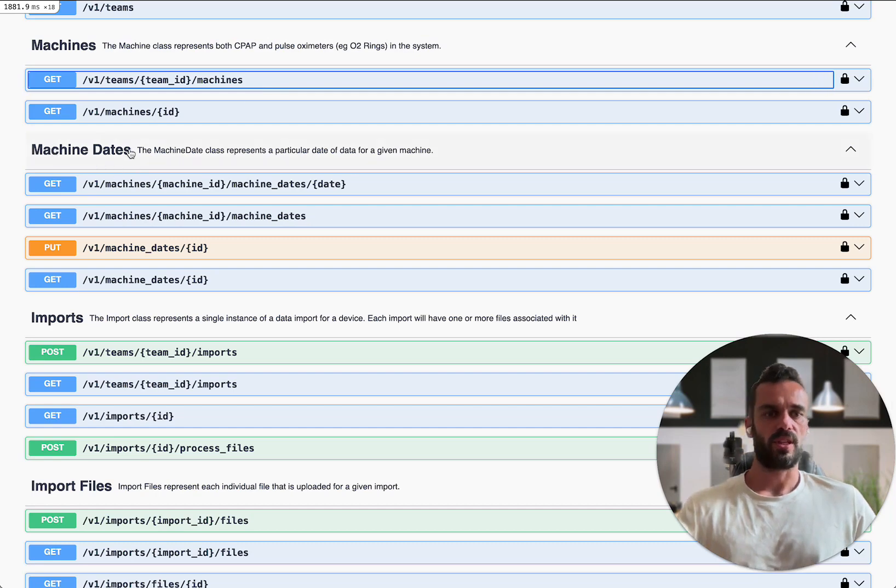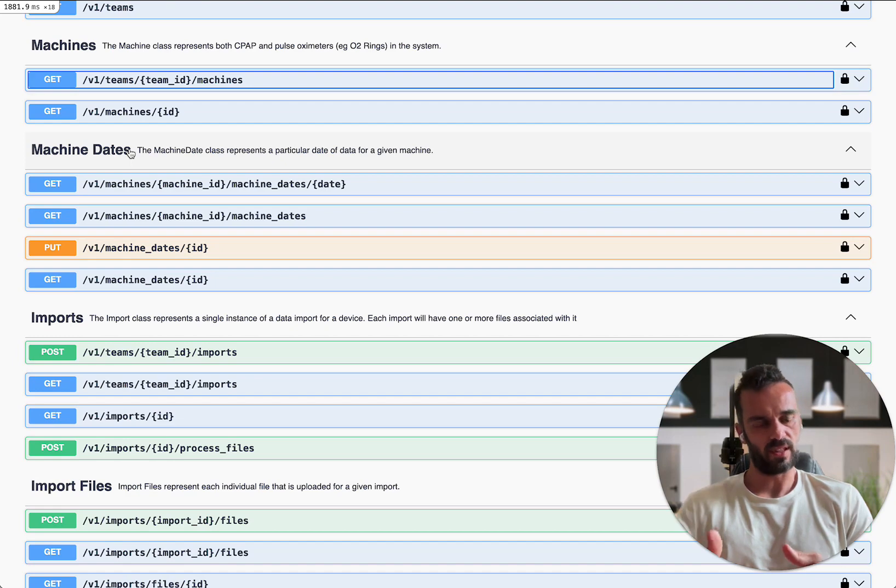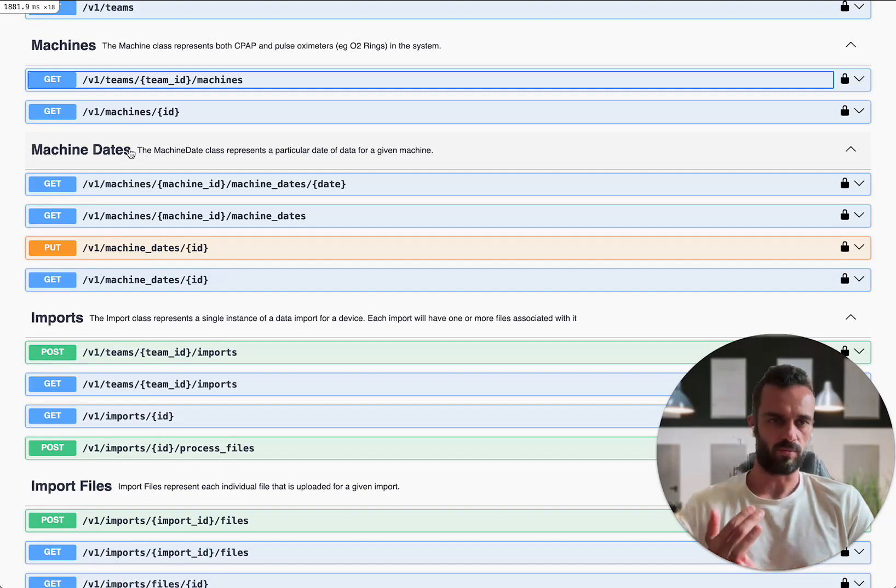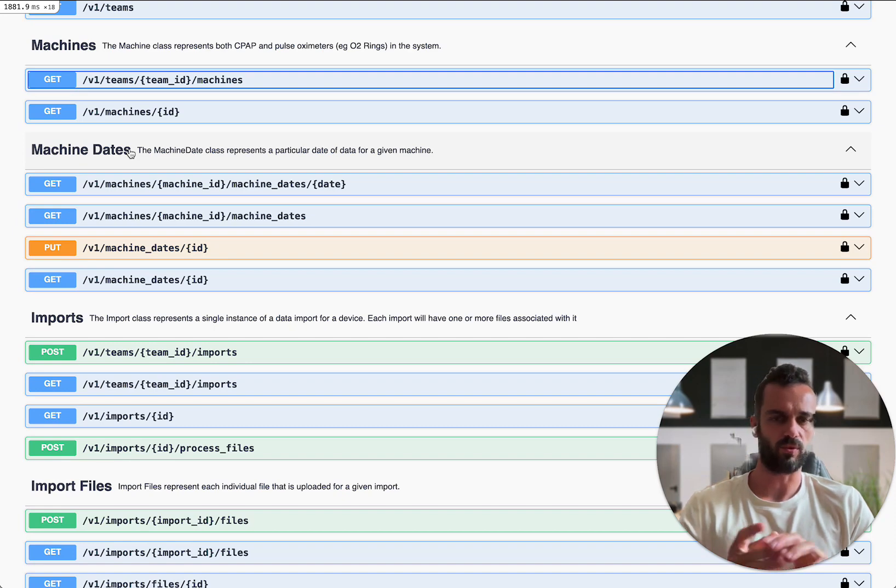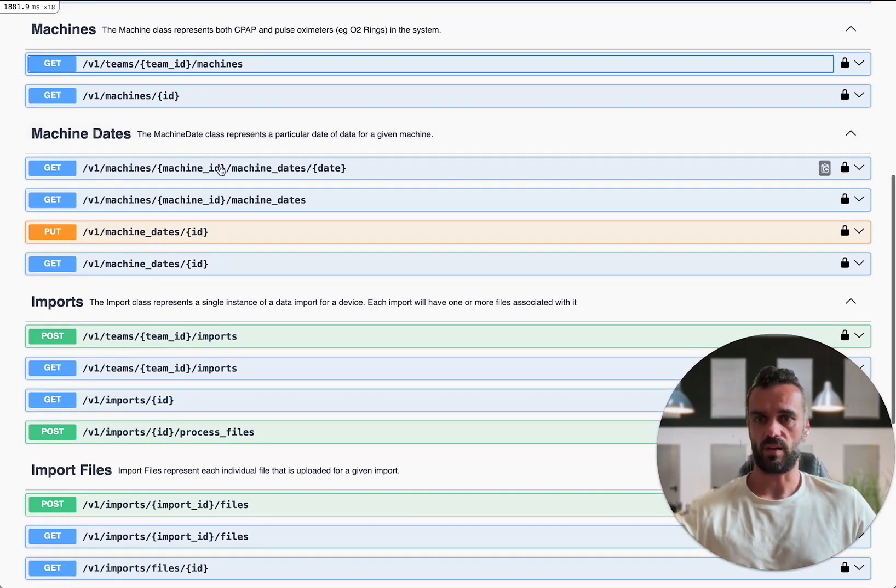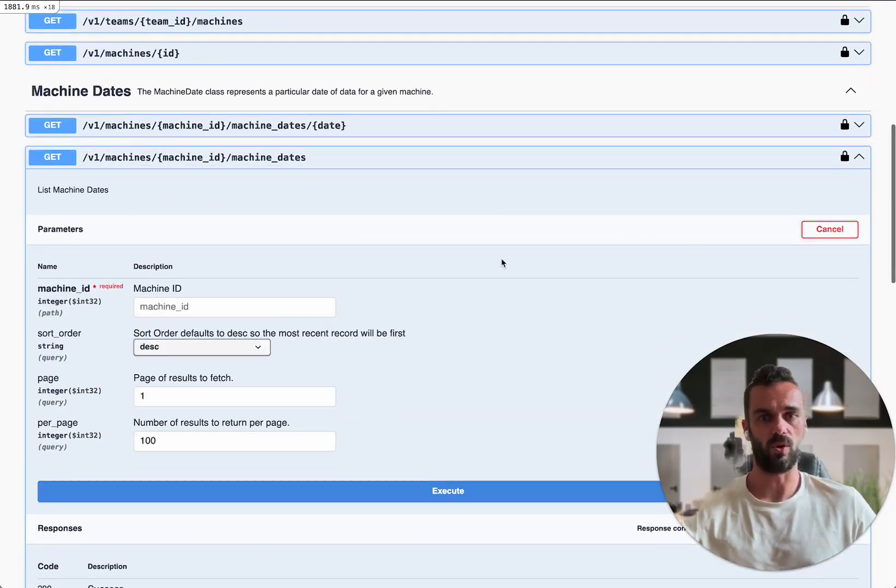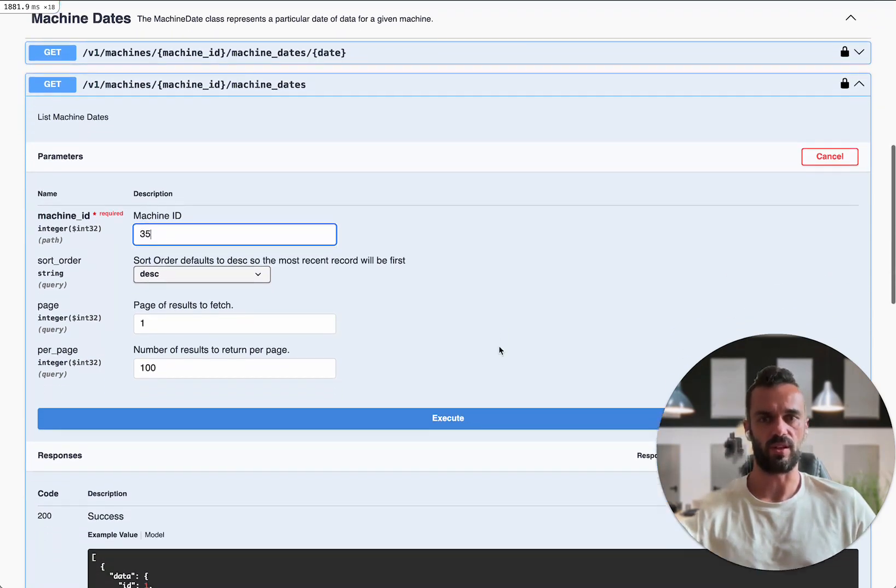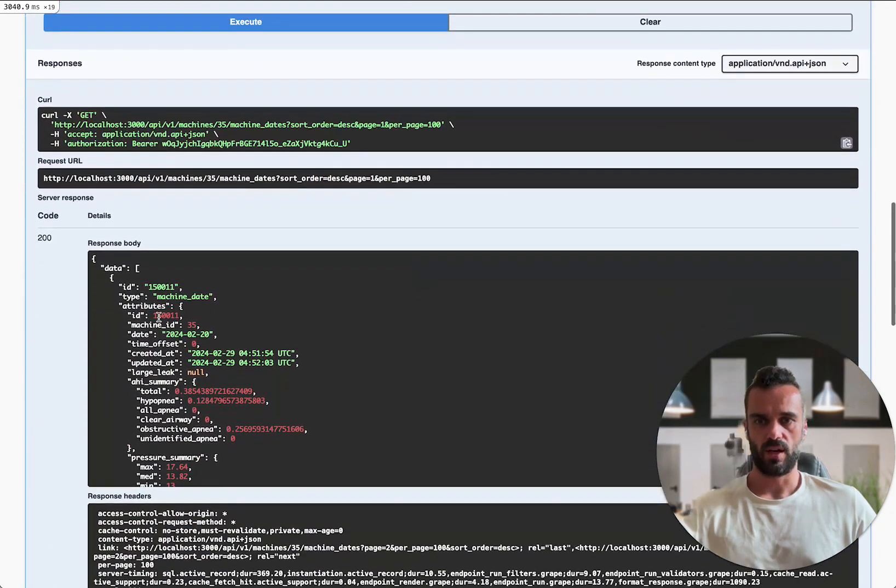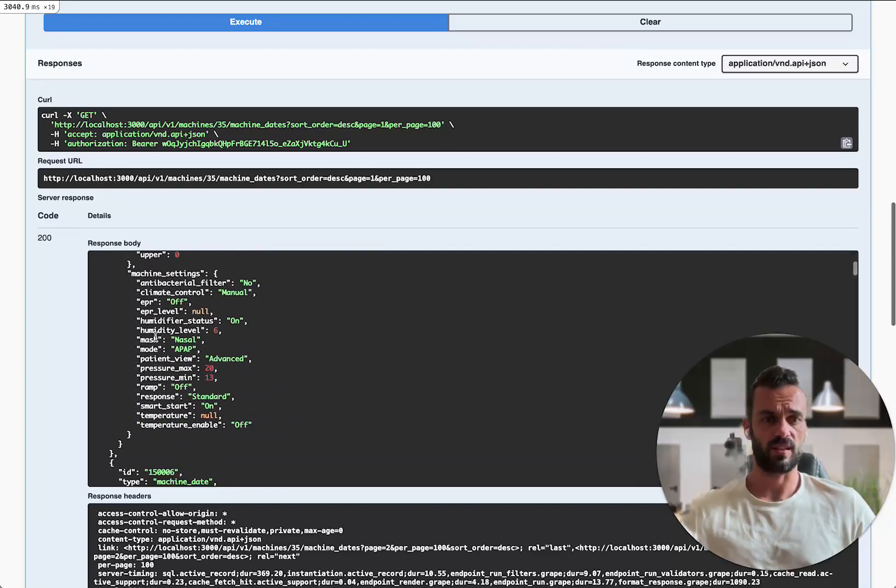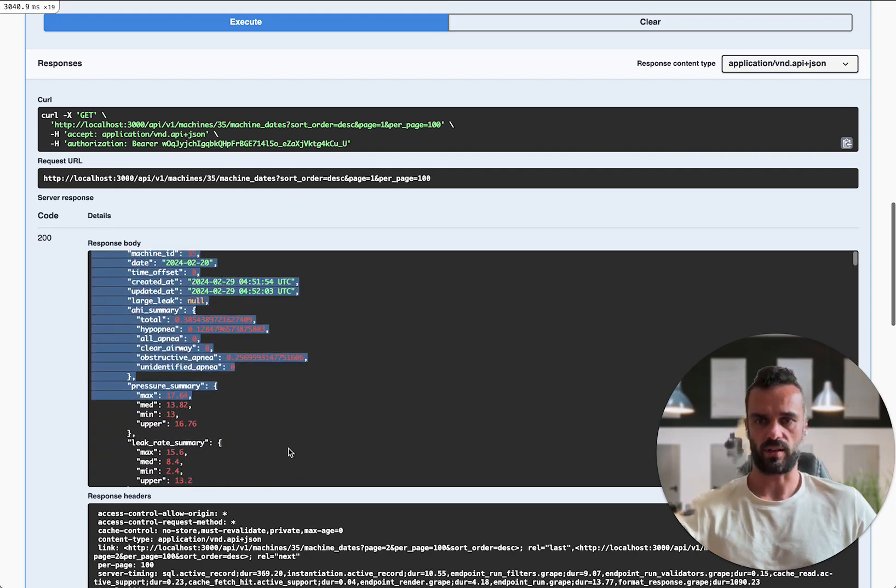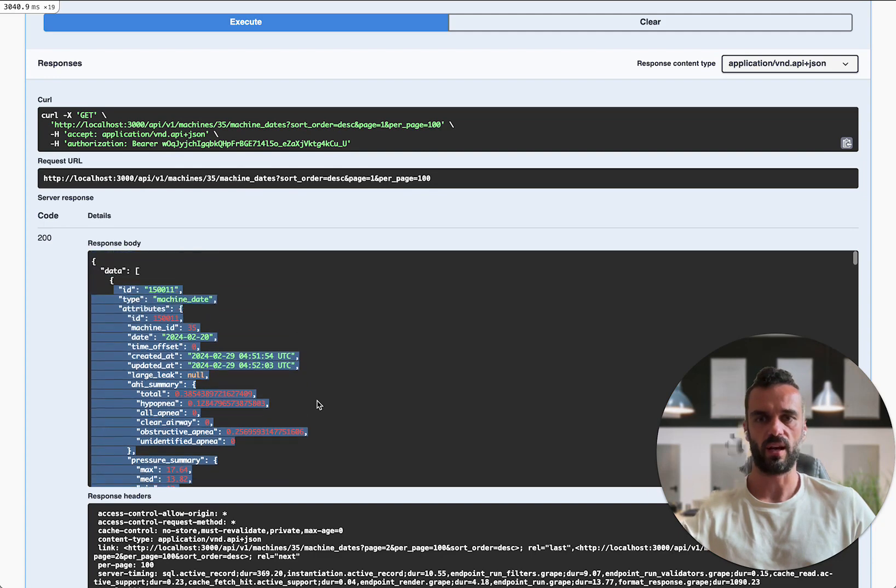Now machine dates is the object that represents the data for a given date from a CPAP machine. This is where you can query for things like your average AHI or pressure or things like that, all the machine settings also for a given date. So once I've got my machine ID, I can go down to here, I can use this get endpoint to list the machine dates. I can just get a full array of all the machine dates for this machine ID number 35. So let's do that now. Execute. And now we've got this array back, which is quite big, because there's a lot of data in there.